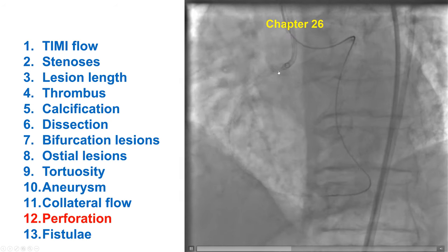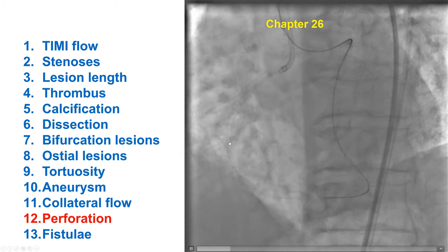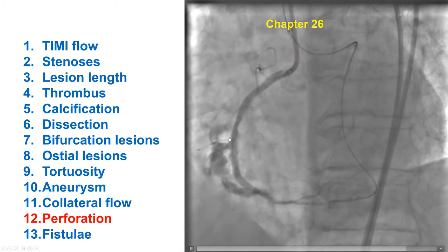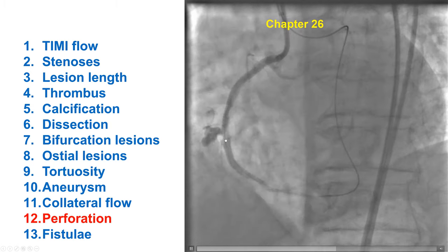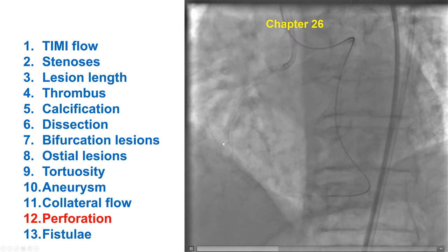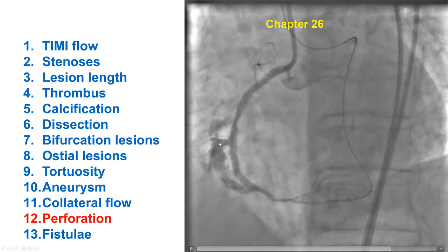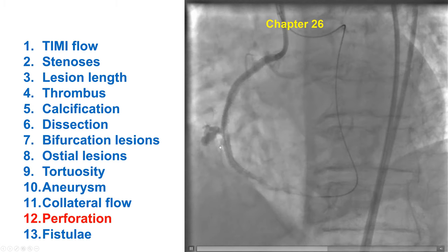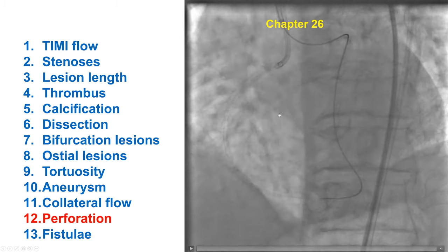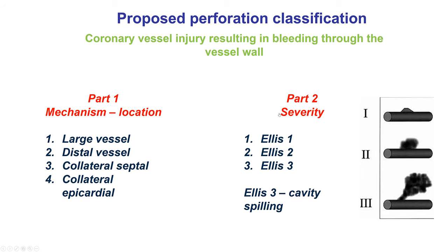Number 12 is perforation. Contrast should flow within the coronary artery and should not extravasate out. This is an example of a large vessel perforation in the mid-right coronary artery, which is critical to identify quickly during PCI because any delay can cause tamponade and be lethal. Different types of coronary perforations are classified by location and severity, discussed in detail in Chapter 26.